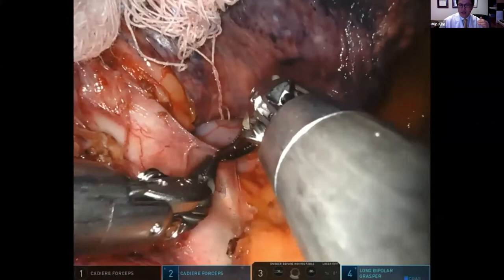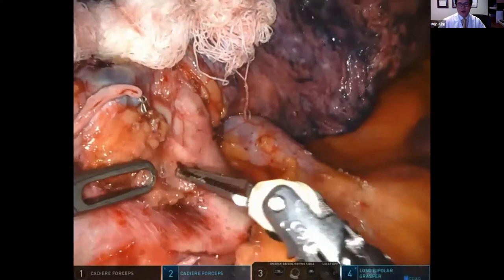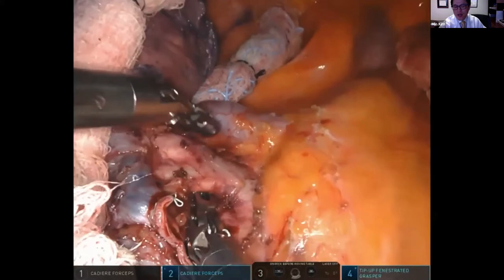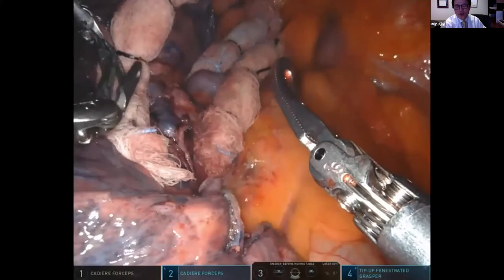For orientation, this is the right upper lobe of the lung that has cancer in it, so we're doing a right upper lobe lobectomy. This is a blood vessel going into the right upper lobe, and the lung is attached to the heart. We have basically a few millimeters between the structures where we have to do this kind of complex dissection. If we're in the wrong place, we can get into the blood vessel and that can lead to significant bleeding, and you would lose your blood volume very, very quickly. So obviously this is a very complex, high-stakes operation.